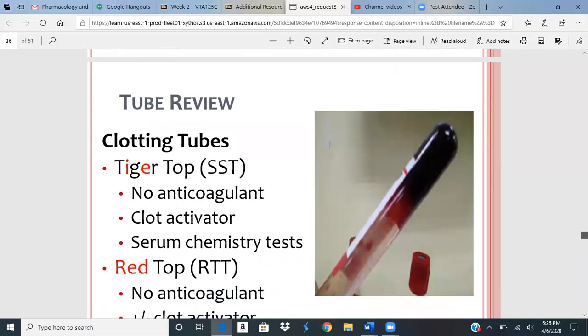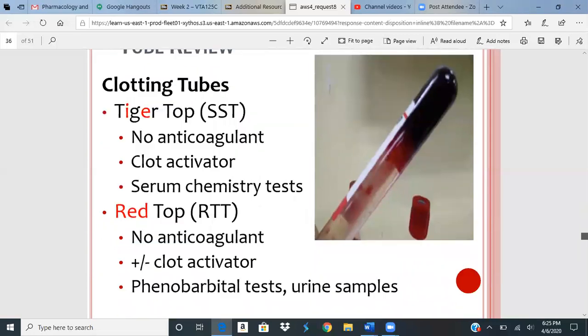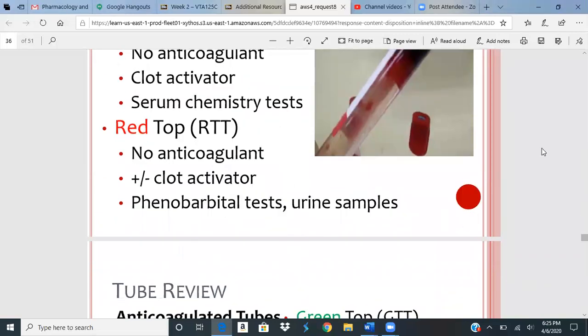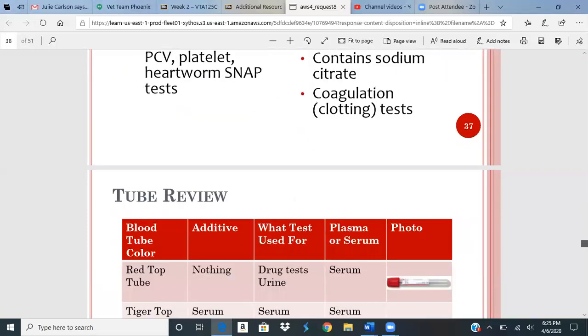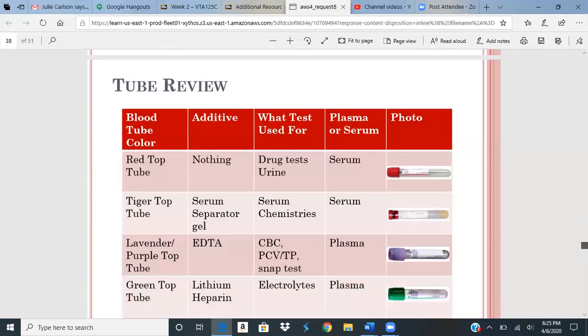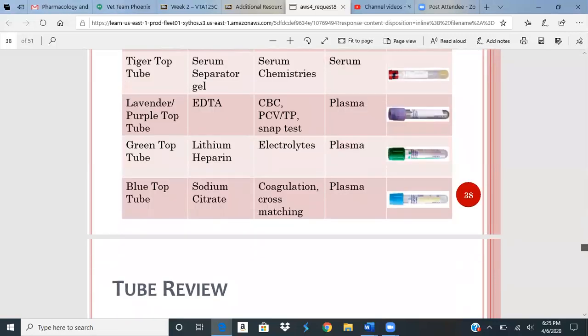Here's some review for you. Tiger top tube. So no anticoagulant. It's going to clot. It's got a clot activator, usually gel in it. And that's for our chemistry tests. Red top tube, no anticoagulant, plus or minus. There's a clot activator. It just depends. Mainly, like I said, remember that the red top tube has nothing in it. We use it for urine. You guys can look over this. And I'm going to go over something later, actually, with you guys for your homework. This kind of breaks everything down for you, and it even has some photos for you of each tube.